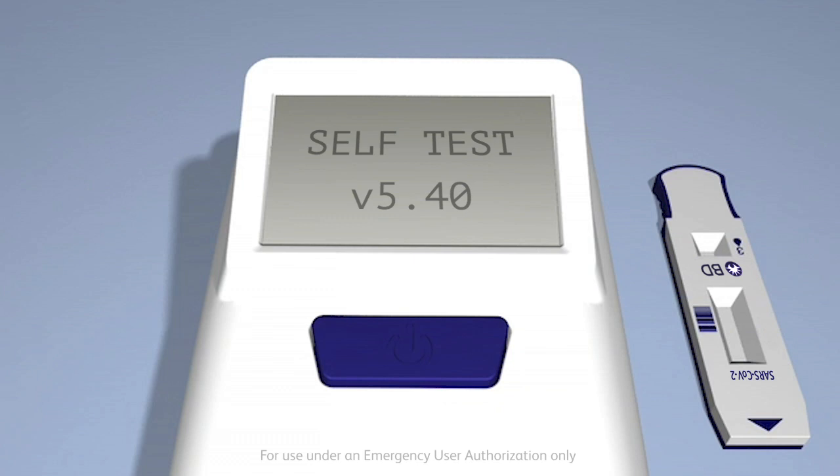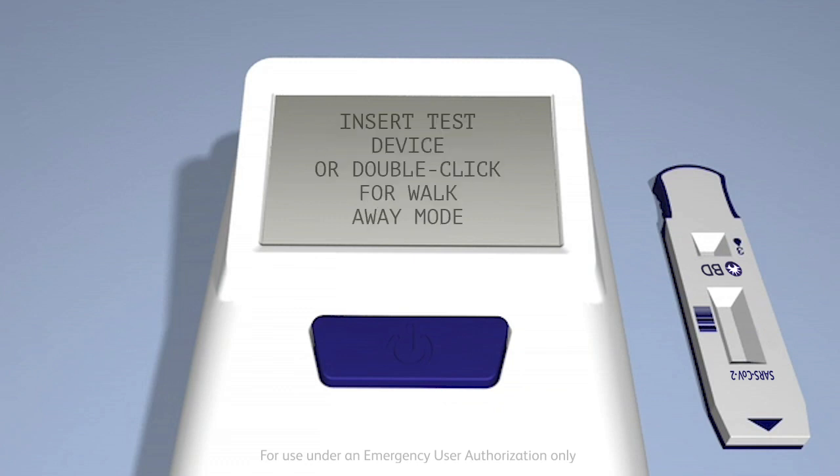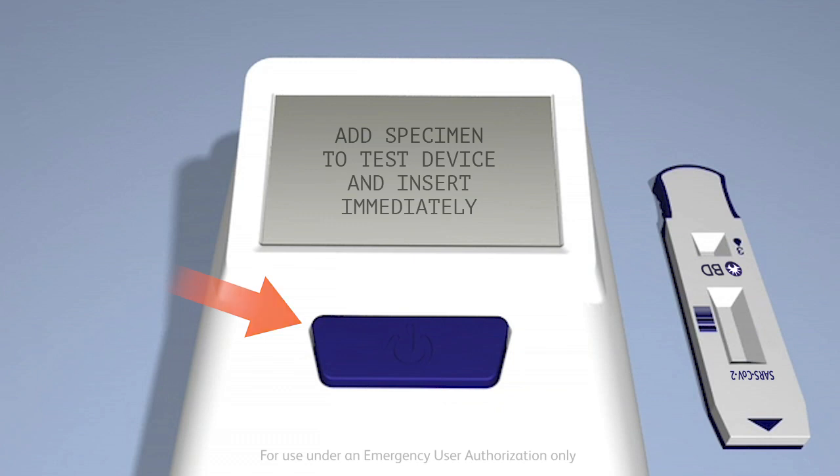For operation in walk-away mode, the analyzer must be connected to the power supply. After the self-check is complete, the display window will show "insert test device" or "double-click for walk-away mode." Double-click the power button. The display window will now show "add specimen to test device and insert immediately."